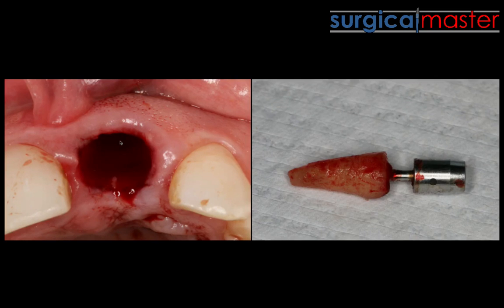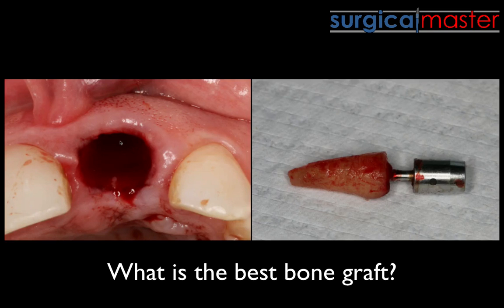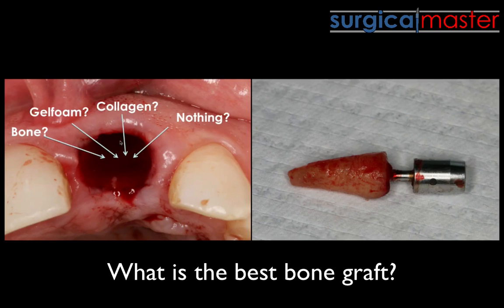I've retrieved roots that were broken halfway in the socket or in the apical third — really tricky cases. There's a lot to consider: what's the best bone graft, the compartment technique, how are we going to graft the socket, do we place an immediate implant? We can place bone, gel foam, collagen, or nothing — we can also use something called a dentin graft.